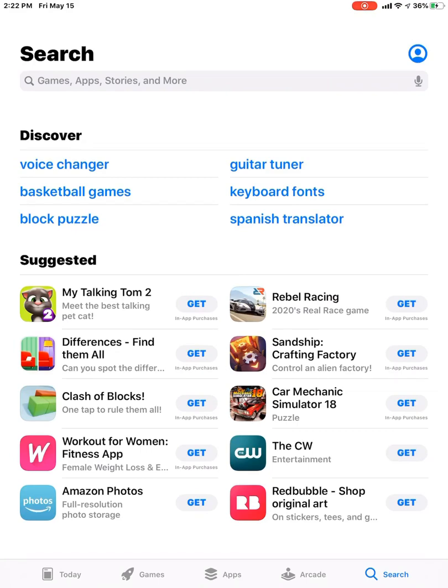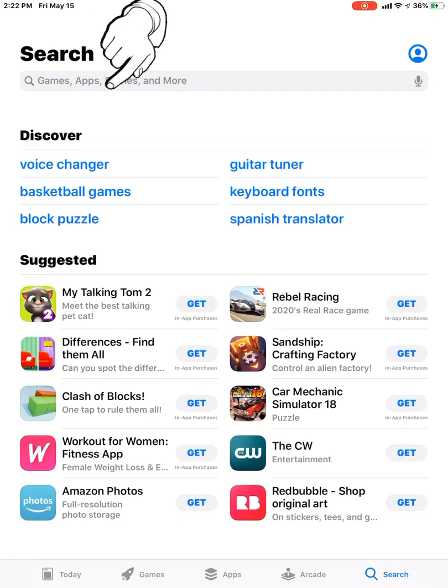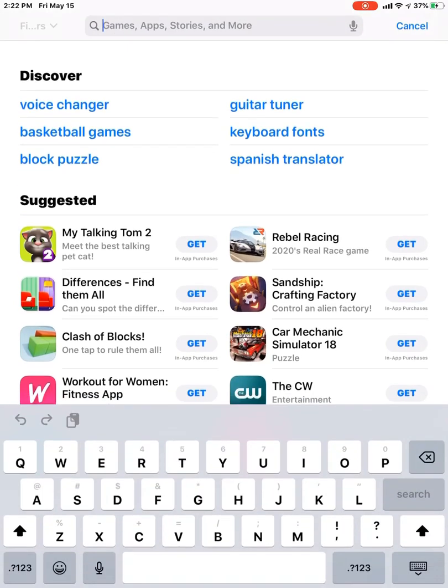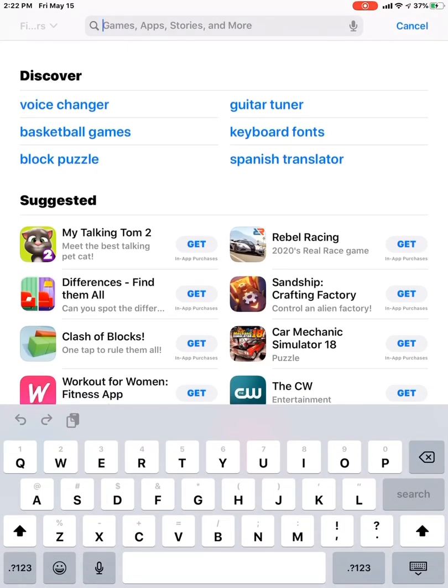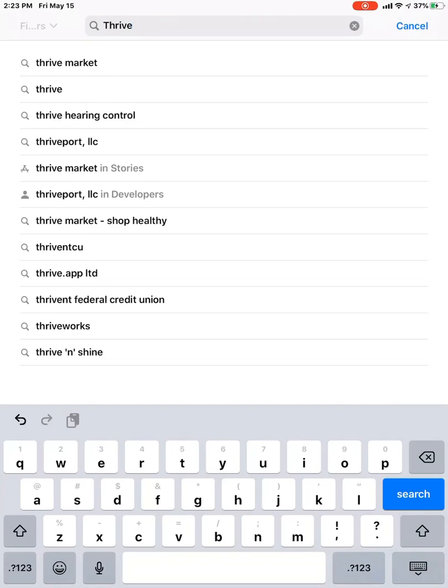So that's how we'll search for our Thrive hearing control. At the top of the screen, we have a search bar or search engine. I'm just going to tap in there and type in Thrive hearing control. And it actually comes up as I start to type.